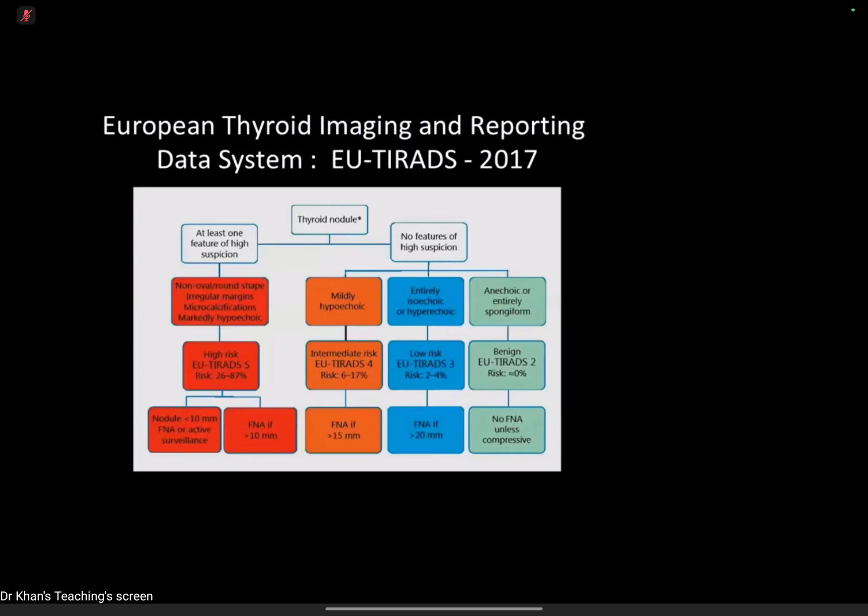So I would perform the aspiration under ultrasound guidance using a small caliber hollow needle, which I would pass through the lesion and agitate to take a fine needle aspiration, which I would then spread on up to three slides for pathological analysis.